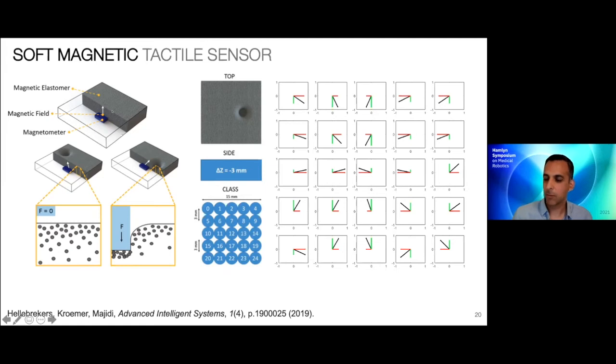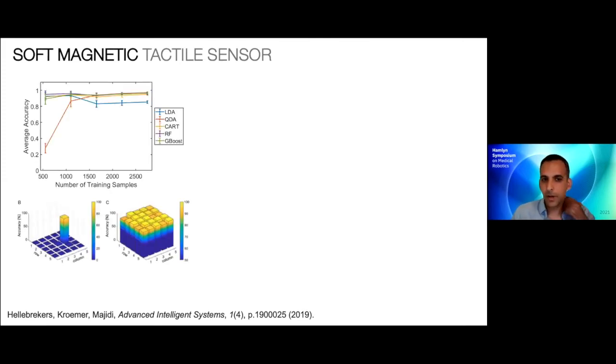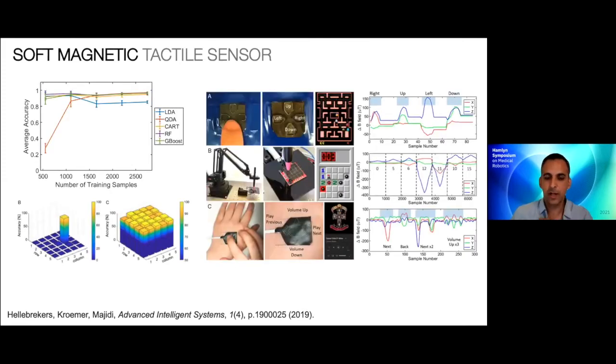And so this represents, for us at least, an advantage over past techniques where we needed a sensing chip or sensing node at every single location where we would want to detect. You would imagine that to get high resolution sensing, that would require a lot of wiring and a lot of sensing chips. So this allows us to eliminate all that and achieve continuous sensing over a large area with just a single chip.